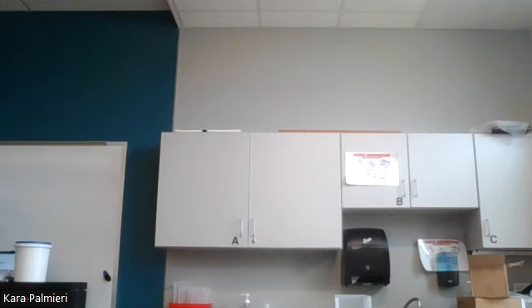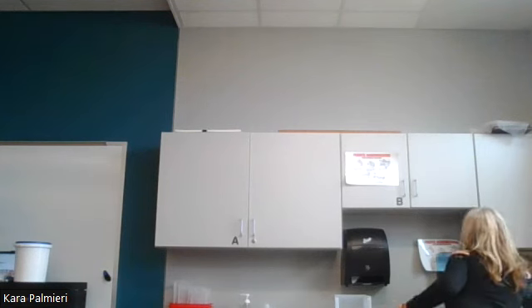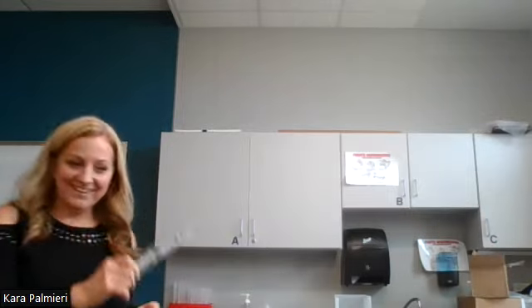So I've gathered my supplies, except I forgot a flush. Luckily, I got one handy right here. So I need an IV start kit, a 10 mil saline flush, a J loop, and I grabbed two IV catheters.